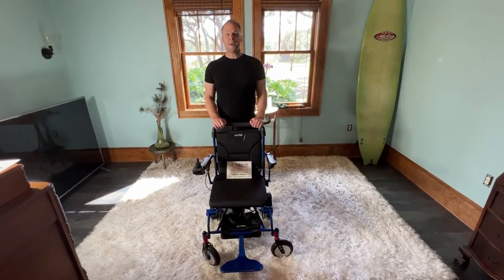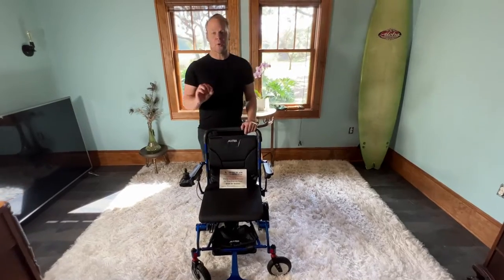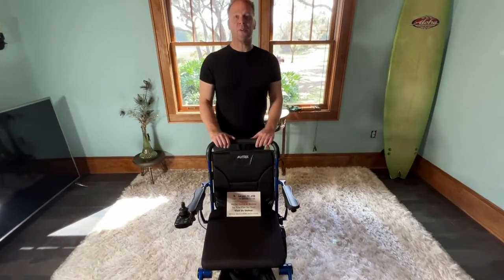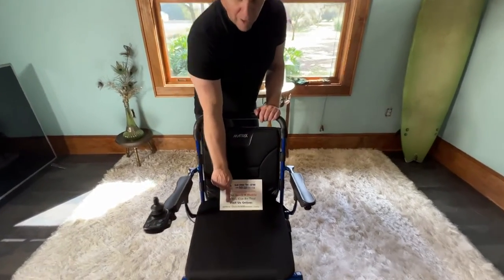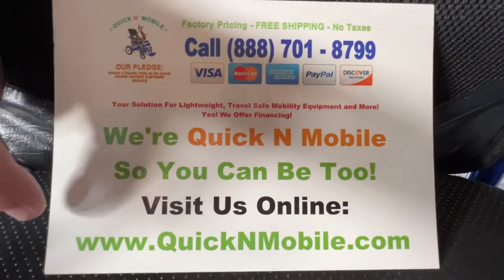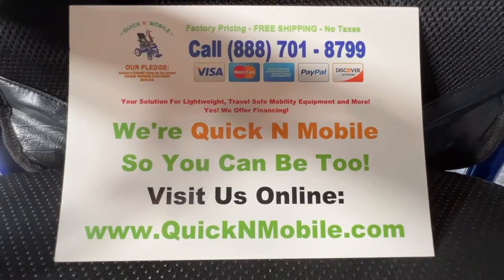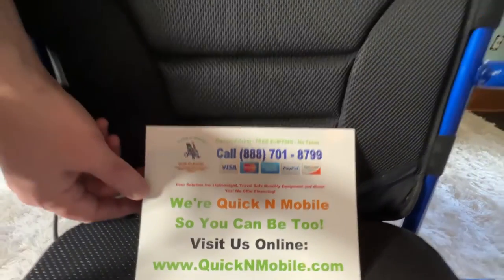Hello, this is Paul from quicknmobile.com. We are here with a matrix chair and we are going to learn how to remove and install batteries. This is part of the video operating manual. You can find us at quicknmobile.com — it works on your phone and it also works on the computer.